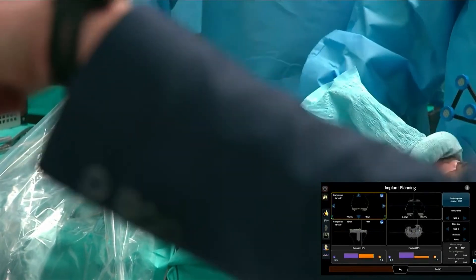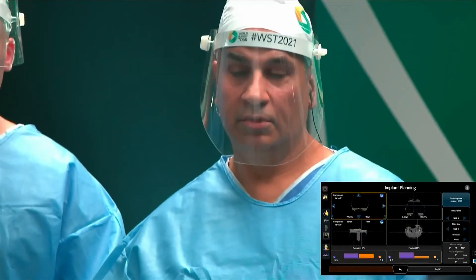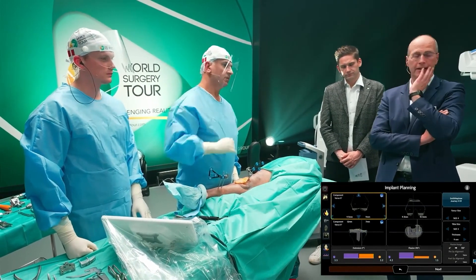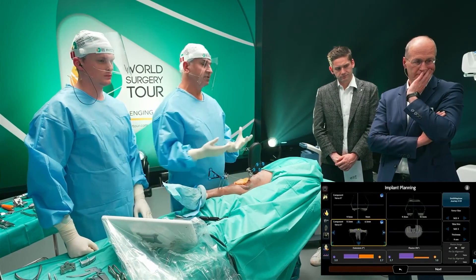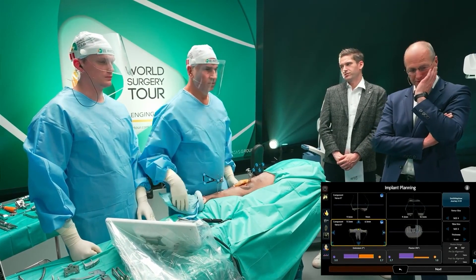The decision to do it on the femur and not on the tibia is because you want to have independent extension and flexion. If I found that the flexion gap was also loose, then I would do it on the tibia — I would raise the tibia. In fact we can raise the tibia a little bit. This is where the surgeon experience and philosophy comes in. It's not the computer telling you what you should do — you have to tell the computer. This is the surgical intelligence.